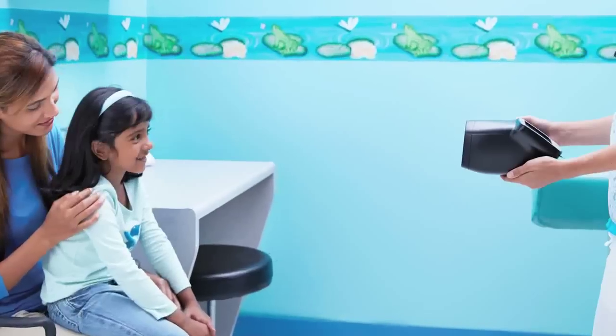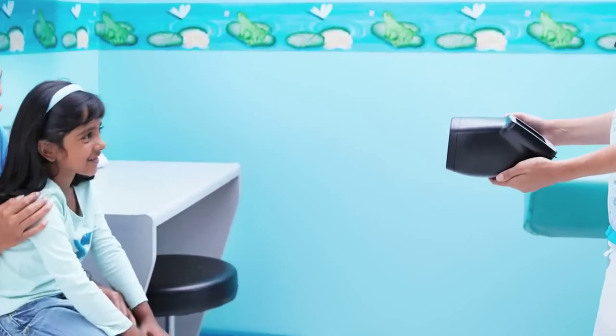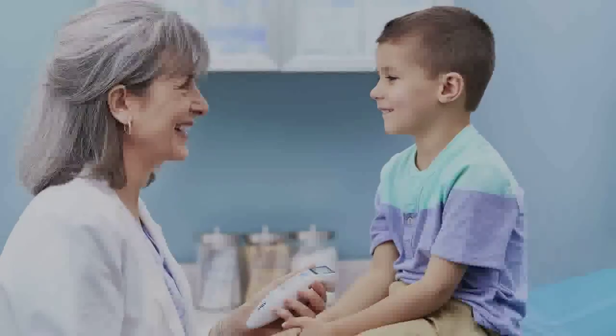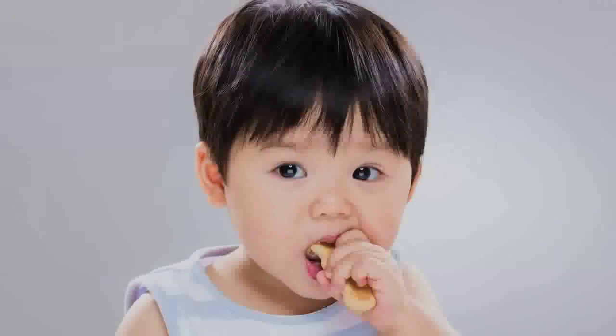Welcome to the Welch Allen Spot Vision Screener. Our award-winning Spot Vision Screener assists educators, health care professionals, and charitable organizations to confidently assess eyesight for all ages.